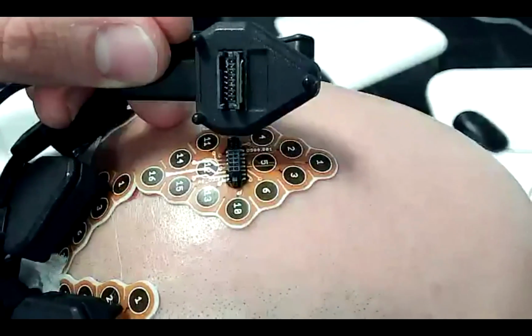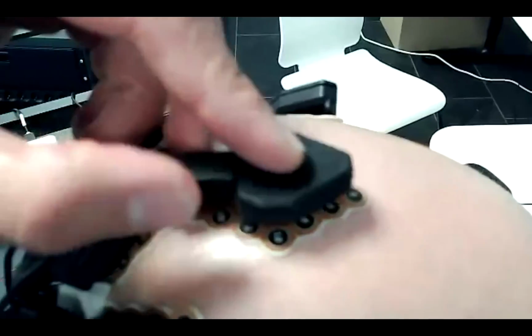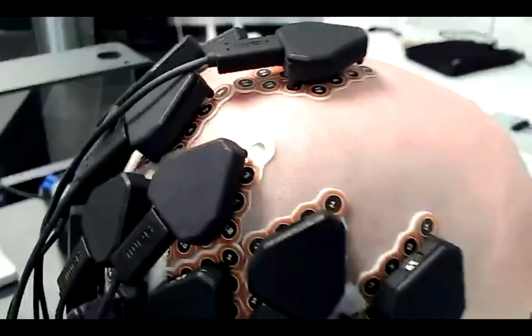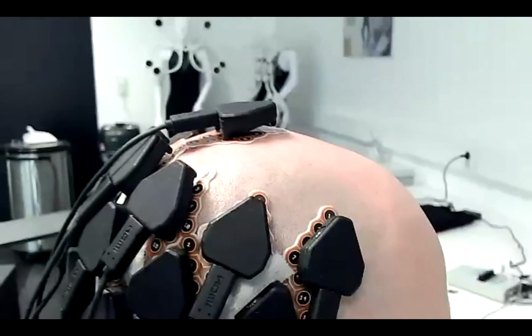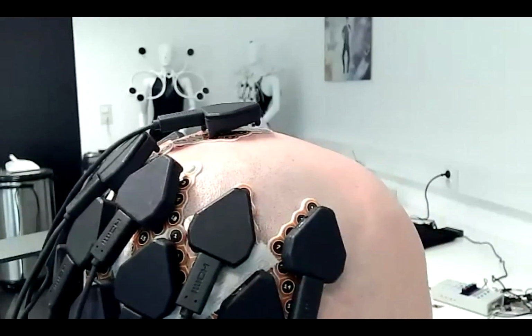You can see here the connector with the 16 channels. I just need to make sure number 1 is in the front and that it's aligned correctly. You don't hear the click, but when I press it in, there is a little click, so you're also sure it has the right connection. And that's how we applied the 16 channels for Cset. So that's how we actually do it with the system.